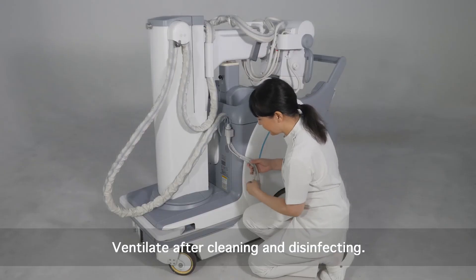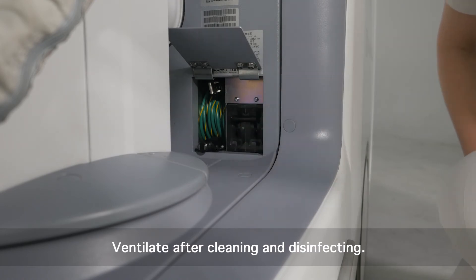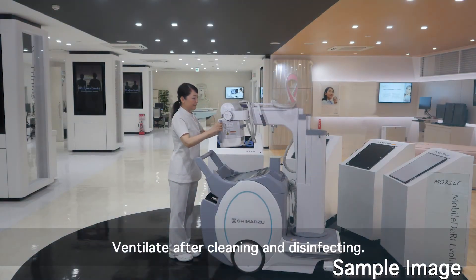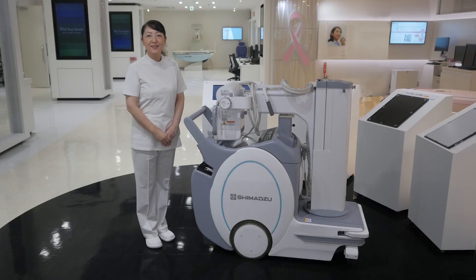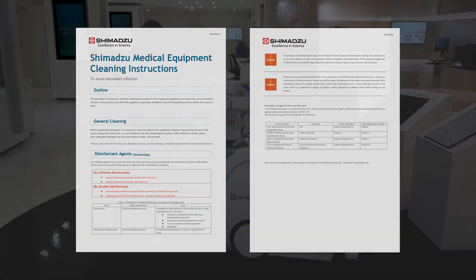When turning the power on after cleaning, make sure the examination room is properly ventilated. Turning the power on while any flammable gas remains in the examination room could lead to fire. For details, refer to the Shimazu Medical Equipment cleaning instructions and the operation manual of each device.